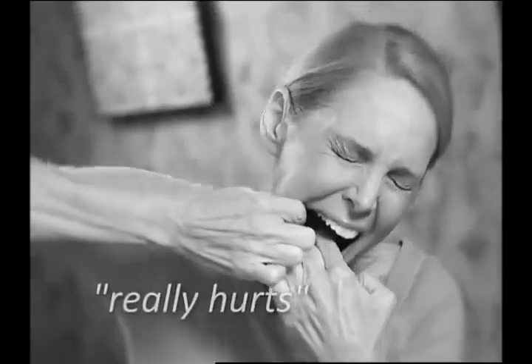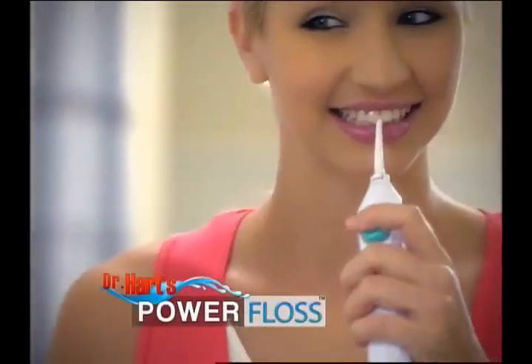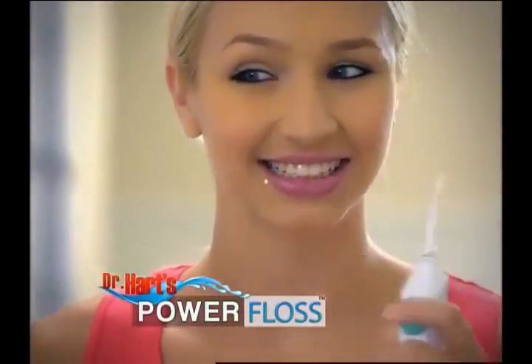I don't have time to floss. It really hurts. The floss keeps getting stuck in my braces. Look, flossing your teeth doesn't have to be such a pain.